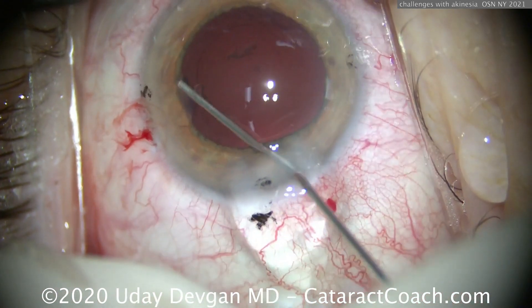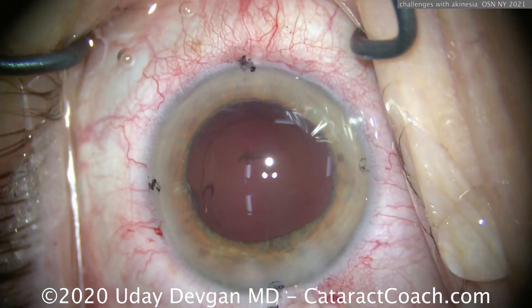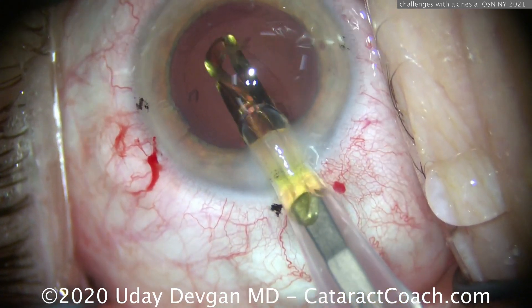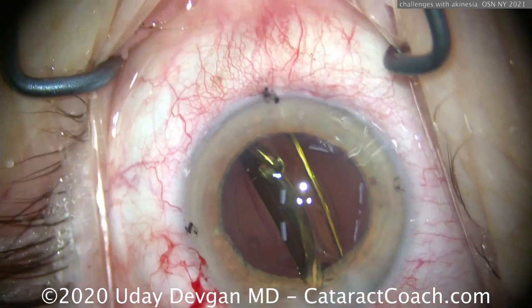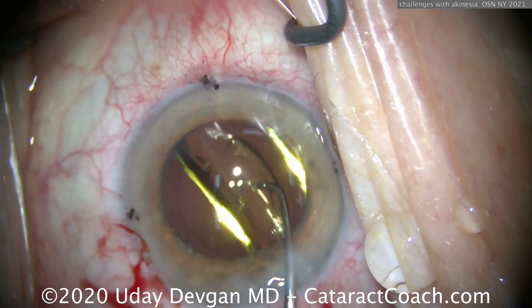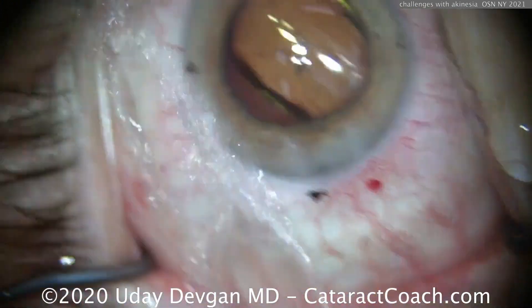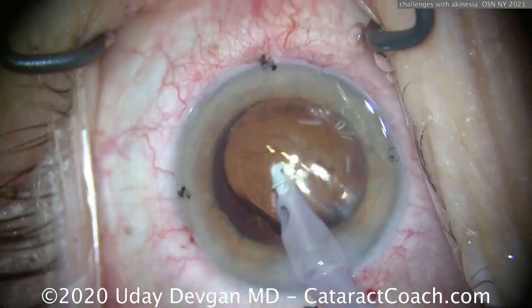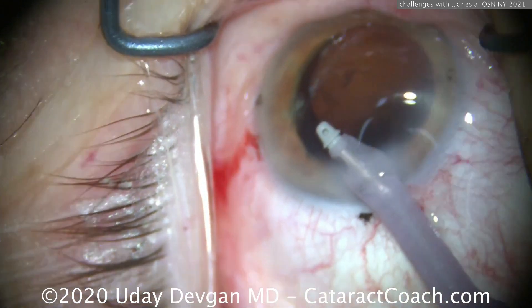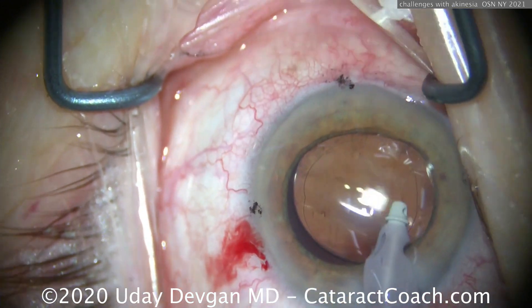The lens is in, the capsule is intact — I'm happy to tell you the case goes well. This is probably one of the toughest cases I've done in my career. The challenge isn't intraocular per se — it's otherwise a normal case; the nucleus is out and the toric lens goes in — but it's the akinesia and anesthesia issues. We've given enough topical tetracaine and intracameral preservative-free lidocaine to numb the eye, so the patient is comfortable, but we just can't achieve akinesia of the head and body. You wish you could give a little propofol, but due to her severe systemic medical conditions, you really can't.